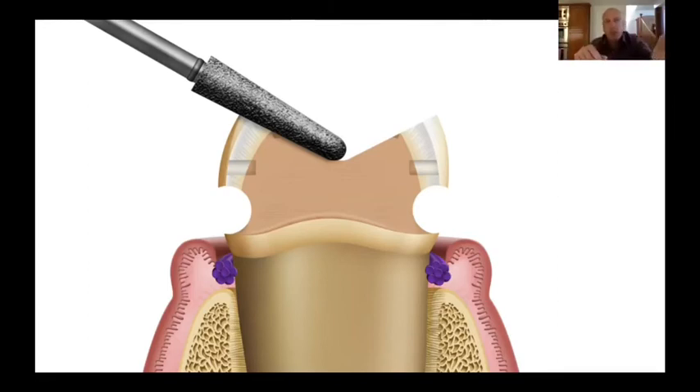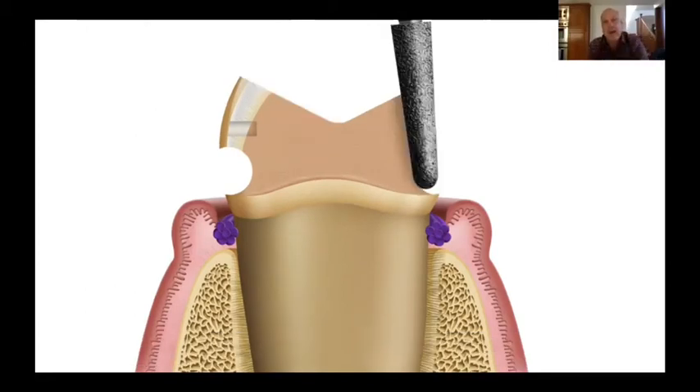We're using coarse or even super coarse grits on this. All of the burrs we're going to be using are either coarse or super coarse until we get to the very end. You can see the reduction we've done here on the occlusal table. Then we're going to take the 856-025 burr again and use it to get rid of our axial depth cut — to prep down to where that axial depth cut is. There's taper built into this 856 shape, so you're basically just trying to hold the handpiece and the burr parallel to the long axis of the tooth. It will give you a taper of around 8 to 10 degrees. The cements we have today, we don't need quite as retentive a prep as we did when I was in dental school using Durelon as a permanent cement. So even if you end up with 12, 15, or 18 degrees for a preparation, that's fine.